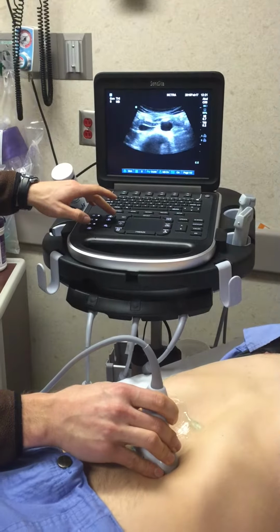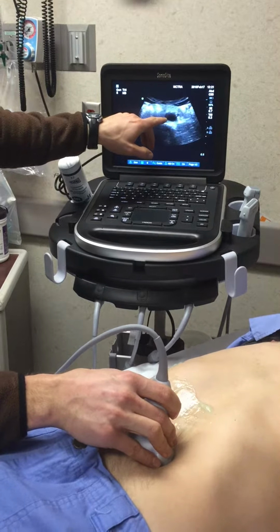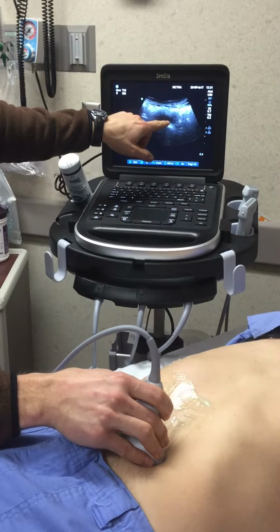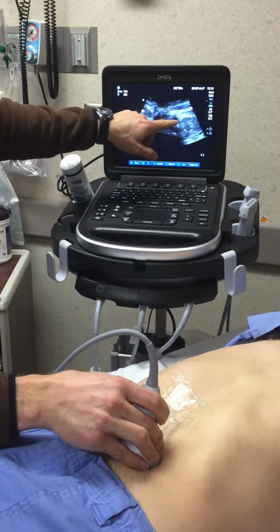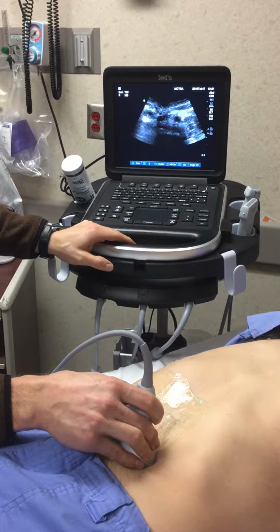You can continue on distally until you see the bifurcation. And you can see it just bifurcates right there, a little bit of bowel gas in the way. There you go, there's the bifurcation. And so all I'm doing is holding steady pressure to get that bowel gas out of the way.